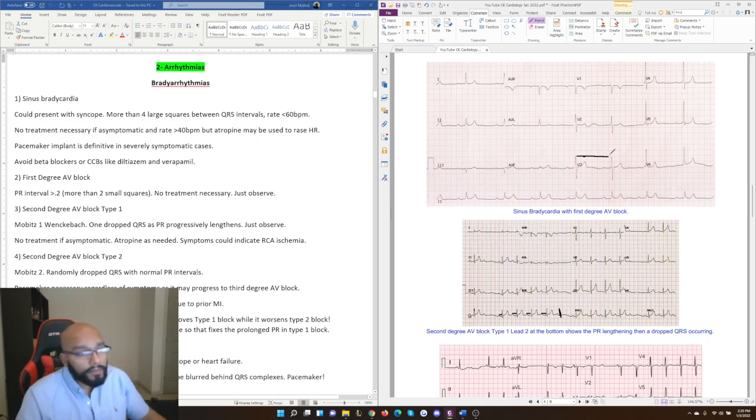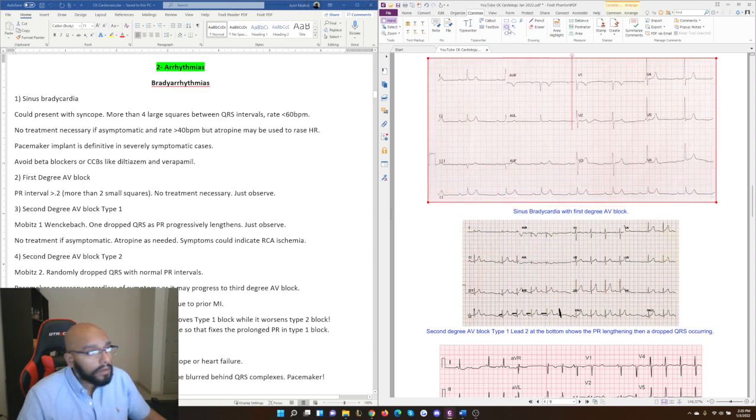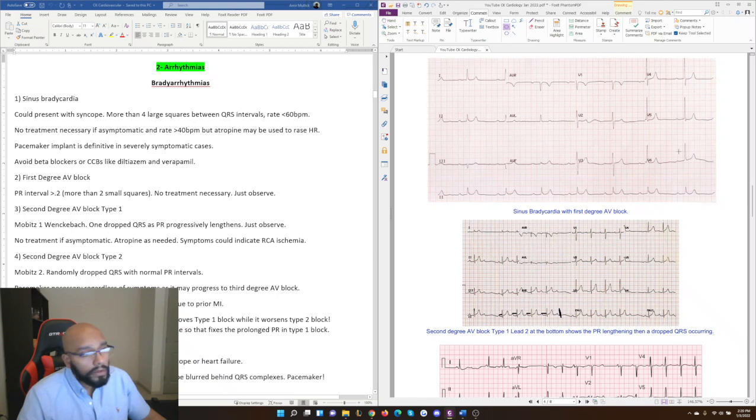That's pretty bad. And then the AV block, there's only one place that's a giveaway that there's an AV block in this patient, and that one place is right here. Work with me. There you go.